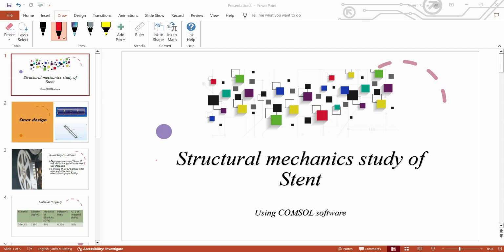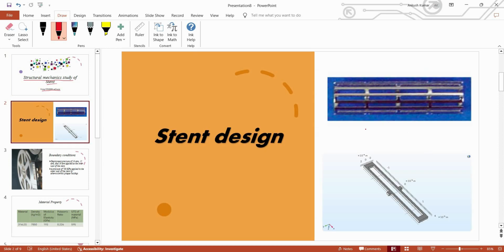So hello guys, today we are going to see a structural mechanics study of a Stent using COMSOL software. As we know, COMSOL is a multiphysics software which is very helpful in performing any analysis of a particular design. So today we are going to see the analysis of the Stent.